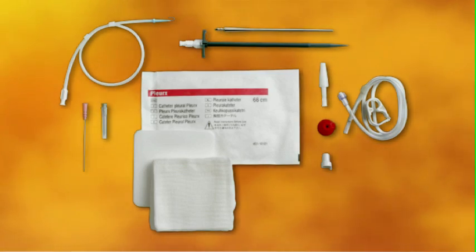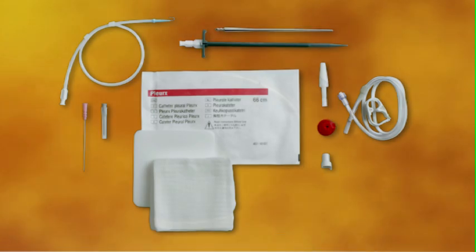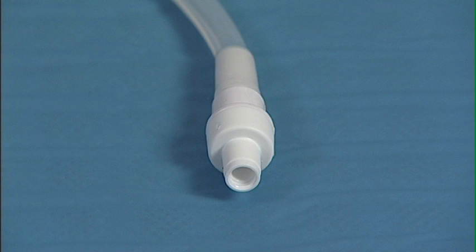The Pleurex Catheter Kit comes with all the items necessary for the placement of the catheter. The Pleurex Catheter is a soft, flexible 15.5 French silicone catheter. Because the catheter is designed to conform to the cavity, it helps to minimize discomfort at the insertion site.